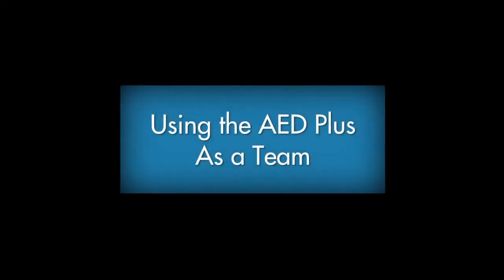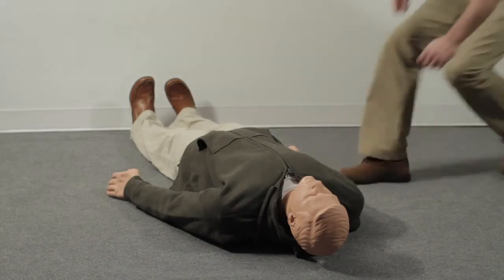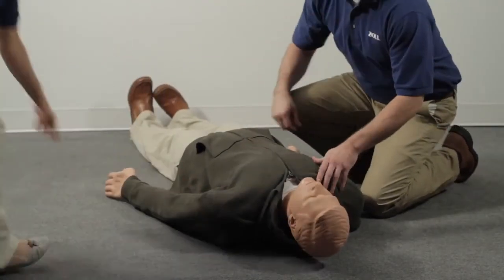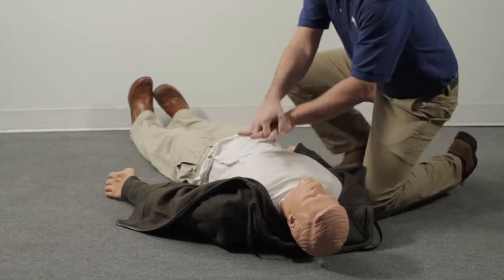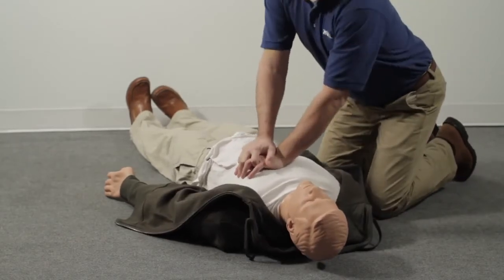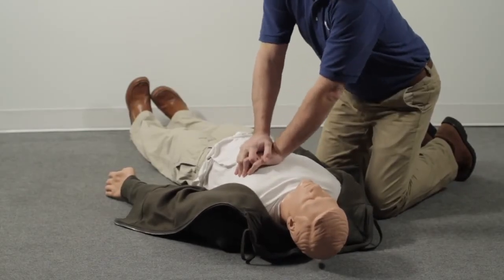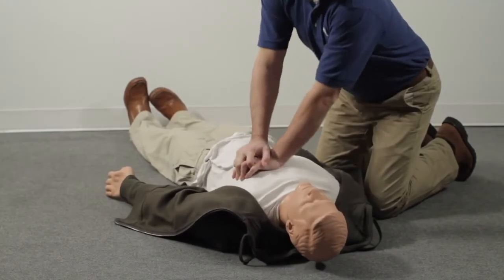Using the AED Plus as a team: let's look at a situation where an AED is used in a team rescue with more than a single rescuer. At work, you see a person fall to the floor. Check to make certain the person is truly unresponsive. Immediately send a co-worker to call 911 or the local emergency number and get the AED. If the person is unresponsive and not breathing normally, expose the chest, place your hands between the nipples in the middle of the chest, and begin chest compressions.